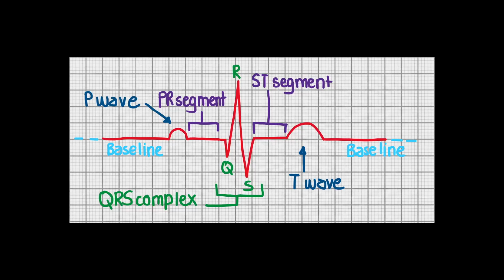What do waves, complexes, segments, and intervals mean? In this lecture, we want to understand the language of the ECG.